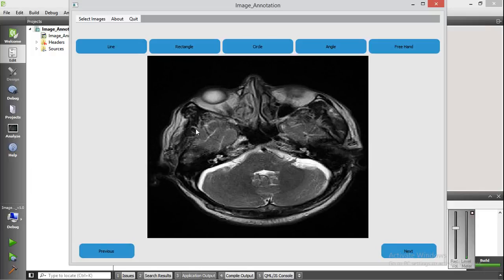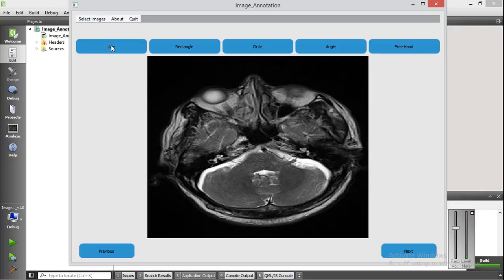This tool provides five different options to annotate the image. For example, you can annotate with a line, a rectangle, a circle, an angle, and a freehand. To annotate with a line, you click on the line option and draw a line on the image.